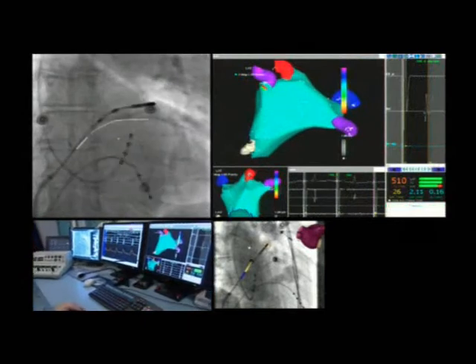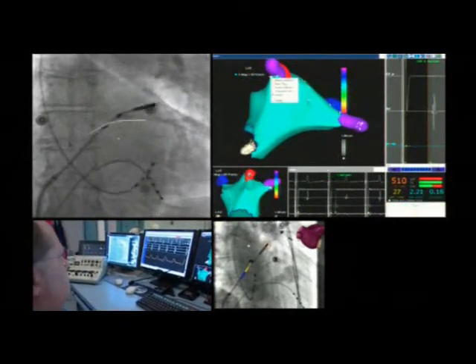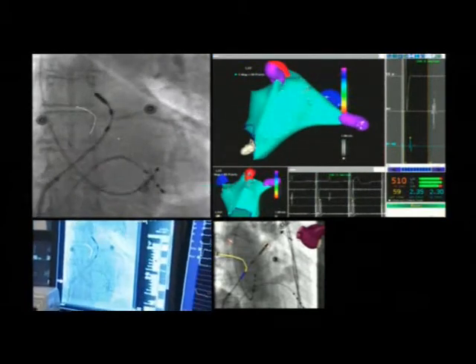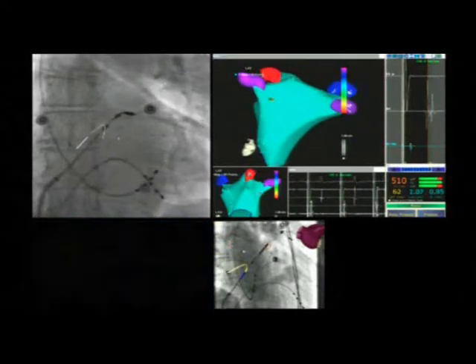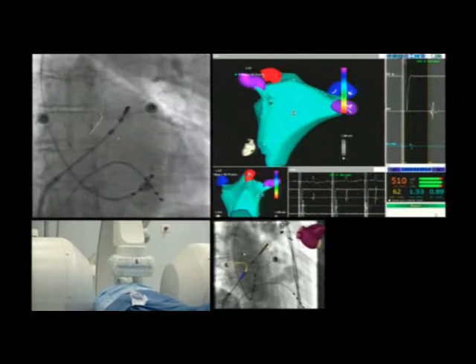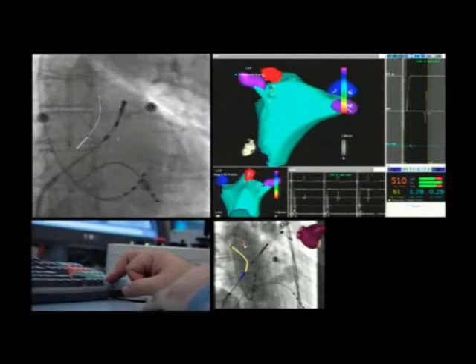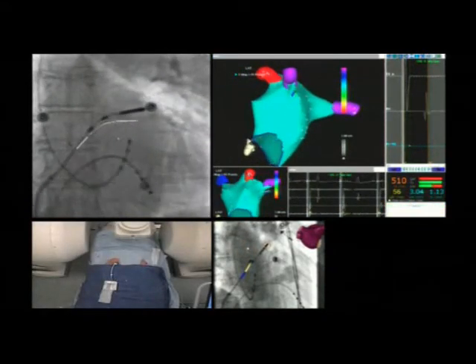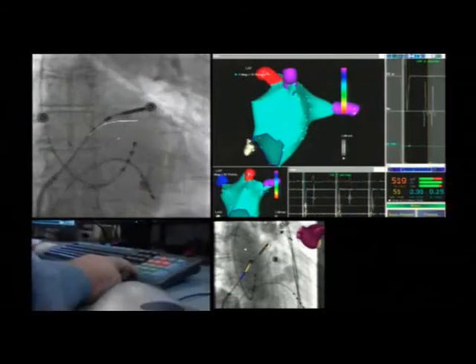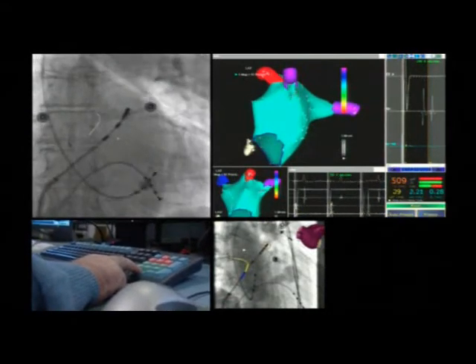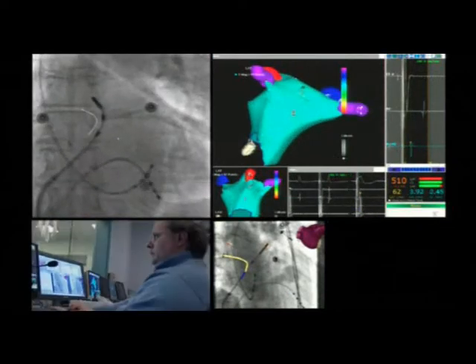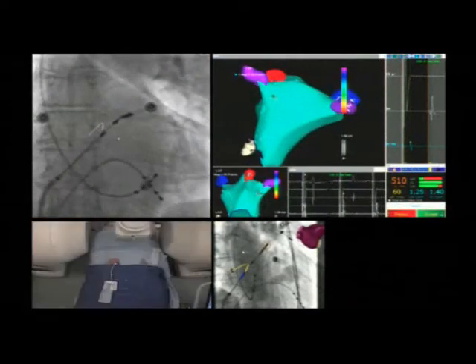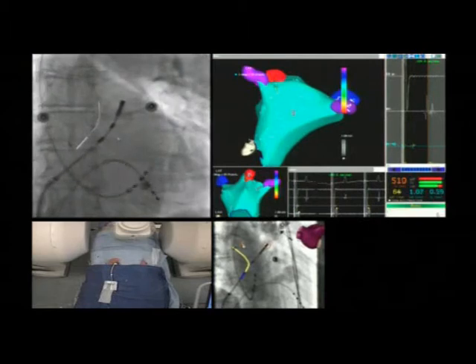This is due to the fact that the maximum and minimum movement of the catheter were set up initially based on the left atrial chamber only. The mapping can be remotely guided by the operator, or it can be automatically obtained by the auto mapping system by continuously pressing the auto-navigate button.